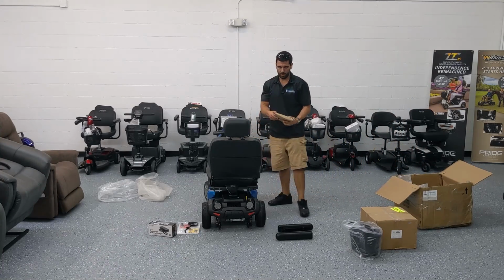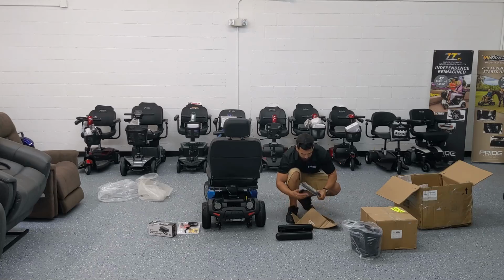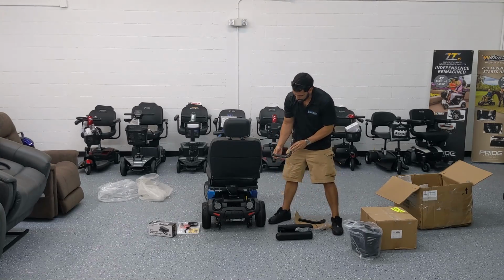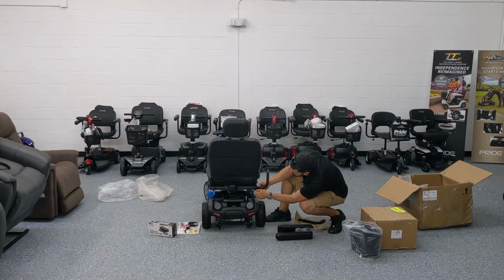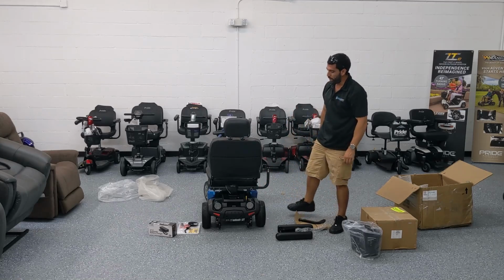The elbows for the armrest come wrapped separately and protected as well in a piece of cardboard. And these work just like the other armrests for any of the other mobility scooters by Pride. Simply install the elbow first. You're going to put that in by releasing the tension knob here counterclockwise until it slides in, and by pulling out the pin. So there's 2 things you need to do. Again, you need to put the pin in. Once the pin's in, adjust the knob so that it's tight and it's not wiggling.